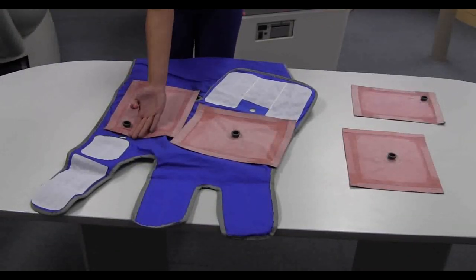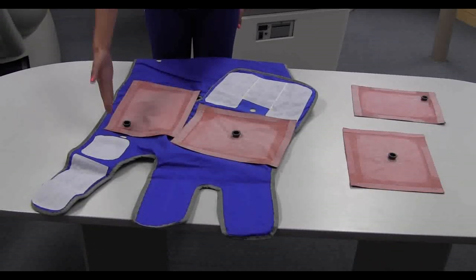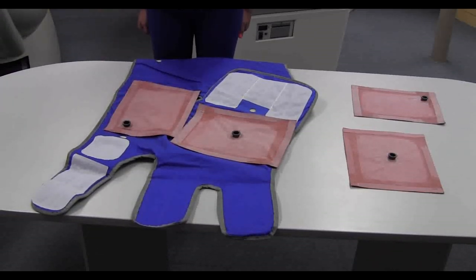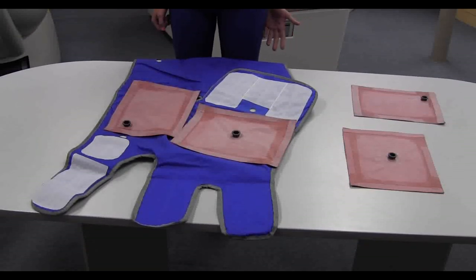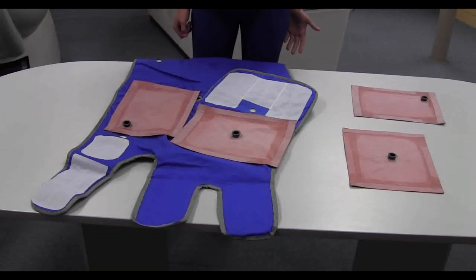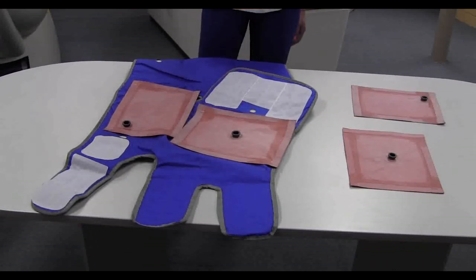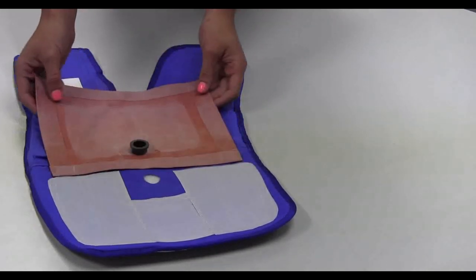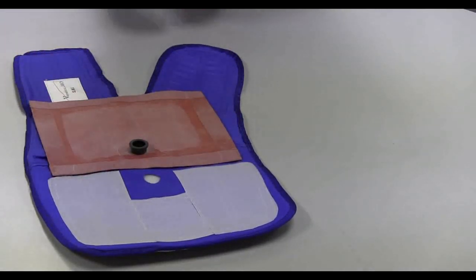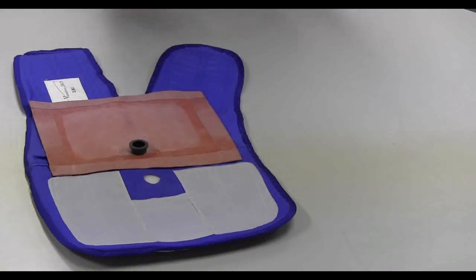Upper thigh buttocks bladders lie across the buttock, with the bladder inlet facing the upper outer corner of the cuff. Lower thigh bladders are positioned lengthwise at the inner aspect of the thigh, with the bladder inlet at the center. Calf bladders lie lengthwise on the lower leg covering the calf muscle, positioned inlet first with the bladder facing the cuff opening.